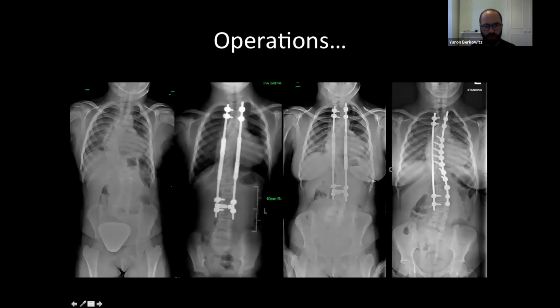With regards to the metalwork conversation we were having before, for deformities, scoliosis is a condition that we operate on mainly in the pediatric population, and kids grow. So there's a system called the MAGEC system, a very clever play on magnetic and magic.